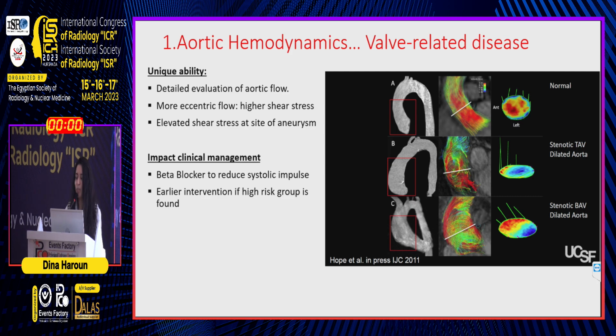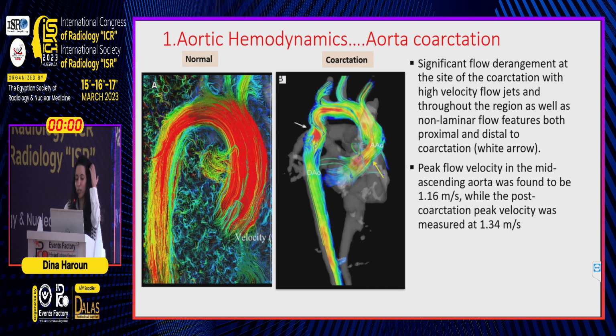It's like a feedback mechanism. We know the effect of the disease and monitor by measuring the quantitative data from the 4D flow and use it interchangeably for better clinical assessment. Dina, can we go to the conclusion, please, Dina?